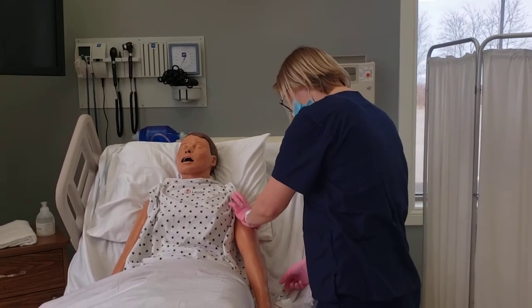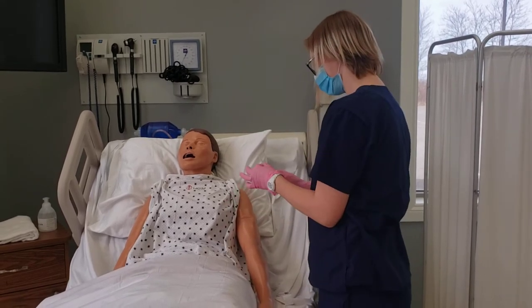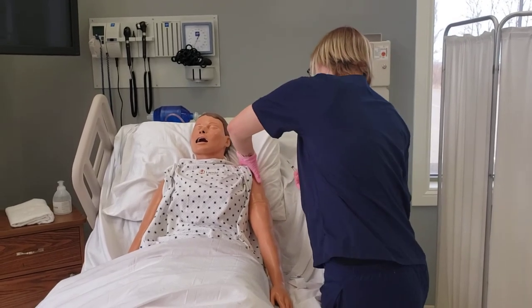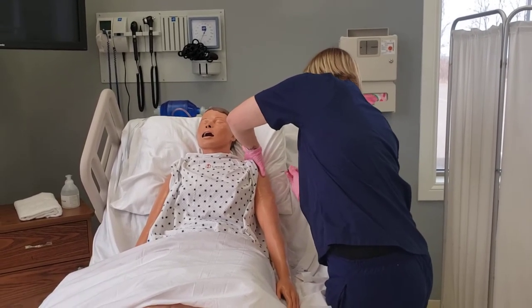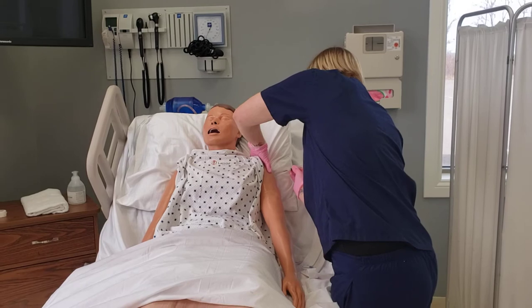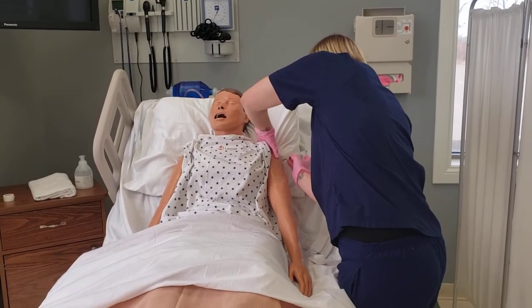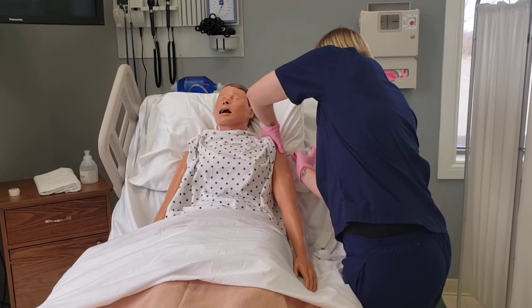She is then going to remove the needle cap with her non-dominant hand by pulling it straight off. She will then spread the skin taut over the injection site and, using her dominant hand, hold the needle so the bevel is up and using a 90-degree angle swiftly pierce the skin into the muscle with a smooth dart-like motion.